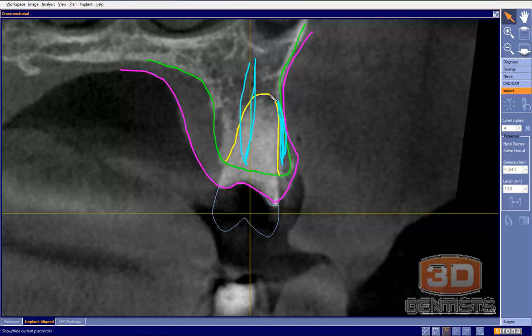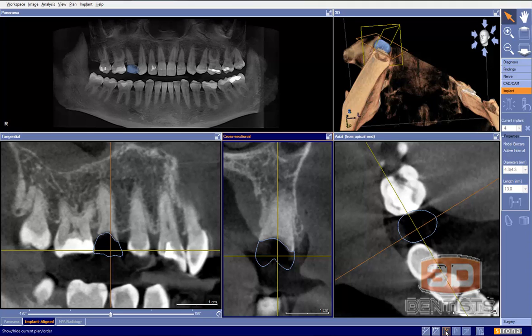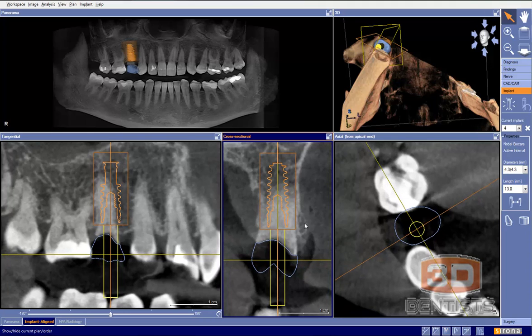The other thing I notice is that the tooth goes up to here, so we know we have plenty of room for apical extension. So I would already guess that this is a very good candidate for immediate placement because I will be able to get stability. Hopefully that thought process makes sense. So we'll make our implant up here. Looking at this plan, the first thing I notice is that from my experience, I generally want to have these implants just a hair deeper. I would probably drop this down just a few millimeters here.